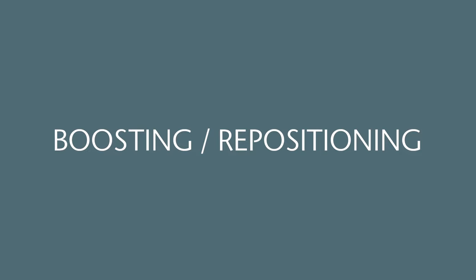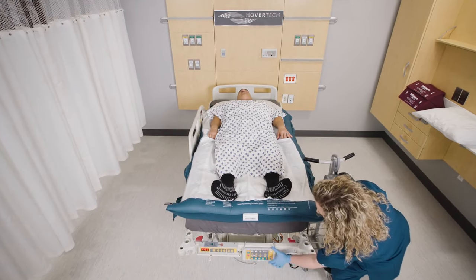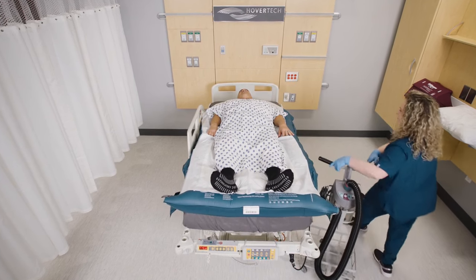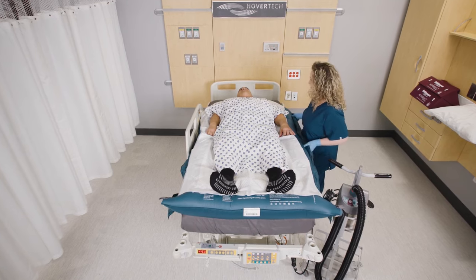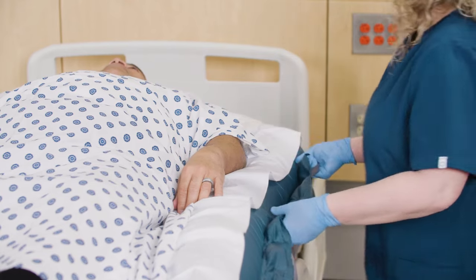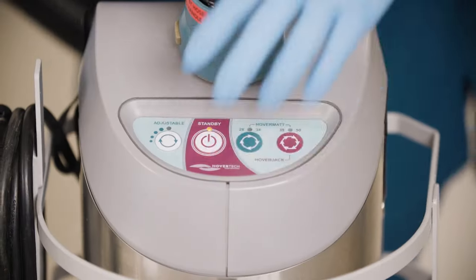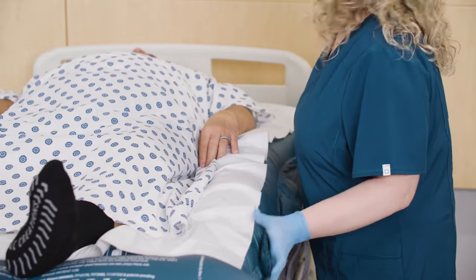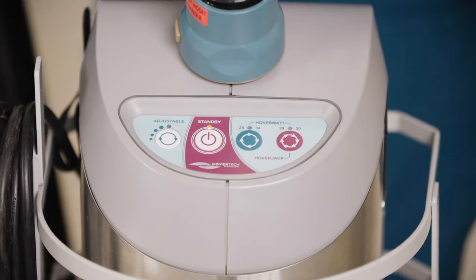Boosting repositioning. Ensure patient is centered on the Pro's AIR. To ease boosting efforts, place the bed in Trendelenburg prior to safely boosting. If using a single caregiver, raise the side rails. When the mat is fully inflated, use the handles under the edge of the mat to boost and center the patient into proper placement on the bed. You can use the adjustable settings on the air supply to straighten the mat and remove any wrinkles.